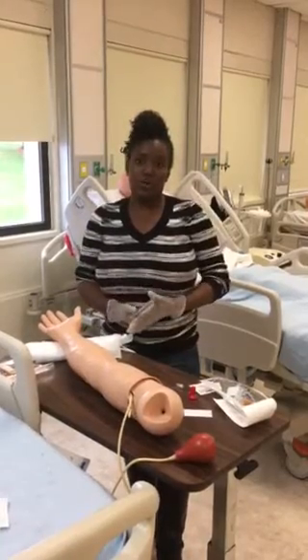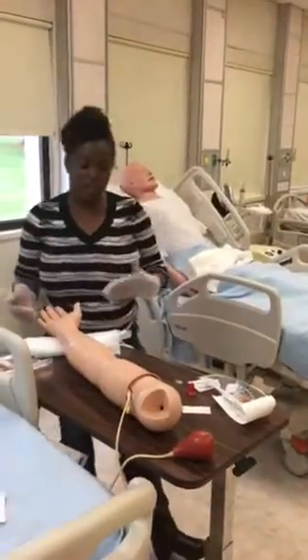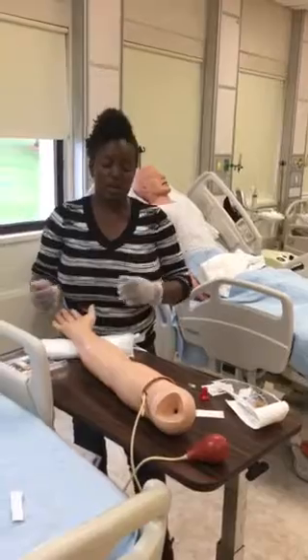I knock on the door. I wash my hands. I enter the patient room. I introduce myself to the patient. Hello, Mr. John. My name is Maria. I'm a respiratory care student. I'm here to do an ABG, which is the blood work.